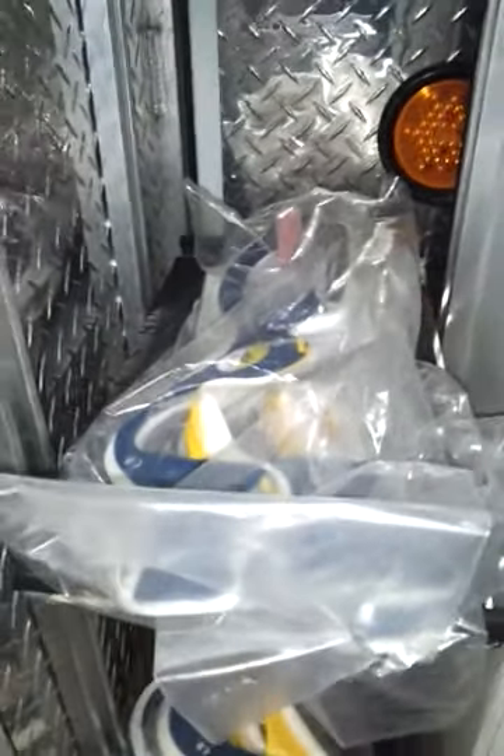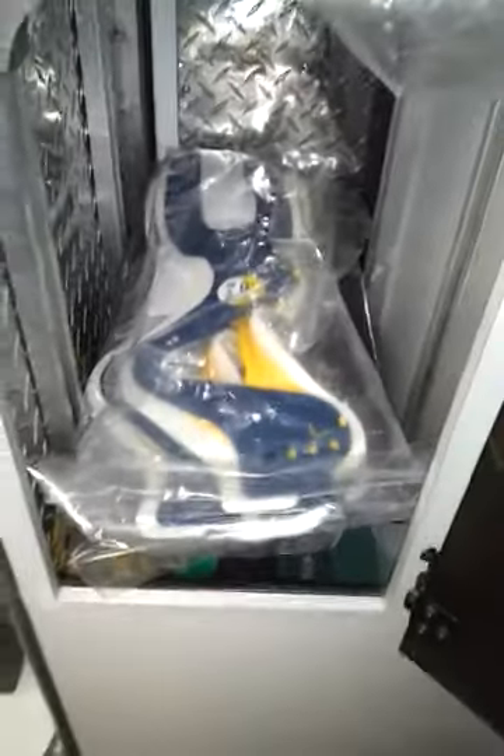In here we have your pediatric c-collars and your adult c-collars. Up here there are N95s, hot and cold packs, and surgical masks.